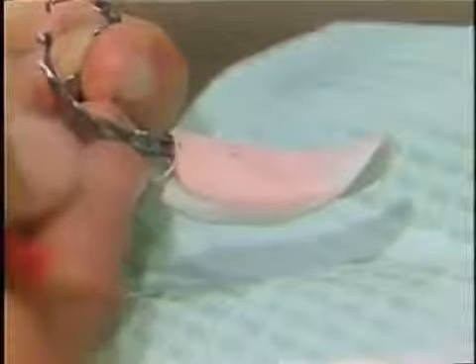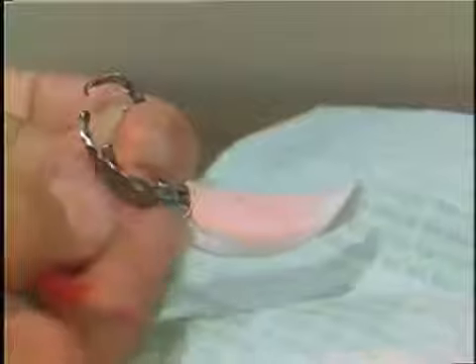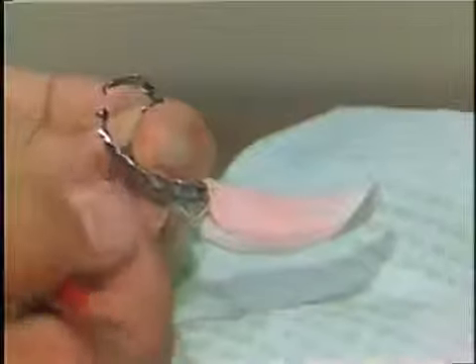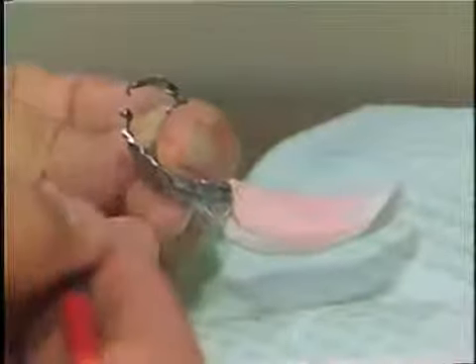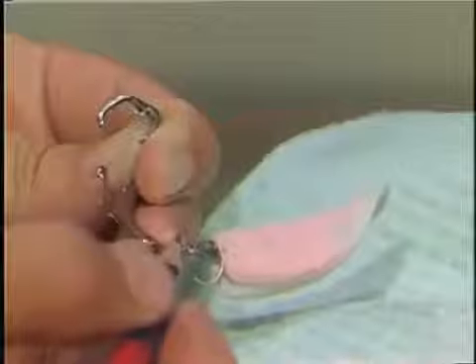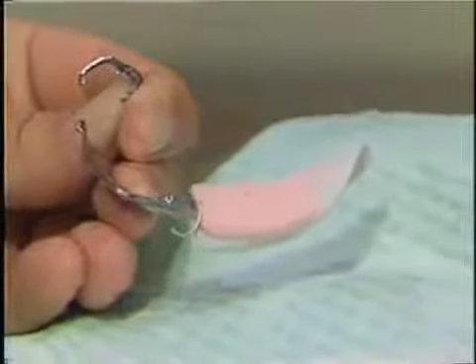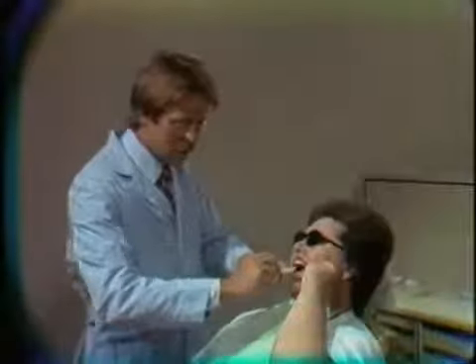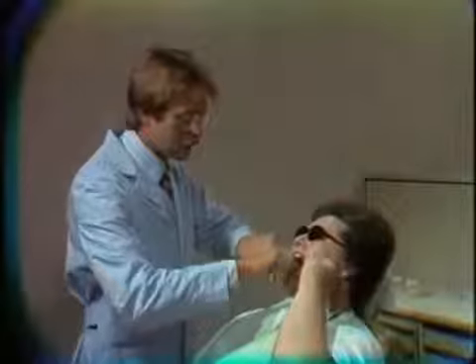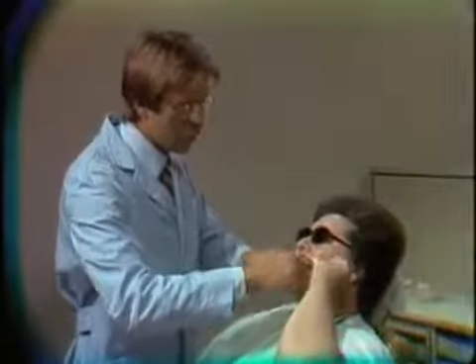We want the patient's teeth to be guided by her musculature, unimpeded by any of the appliance that we're placing in the patient's mouth. And we see that we have some remnants of these little eccentric dots that we had placed previously. Now we have to take this back to the patient's mouth to double check that it does not interfere with the patient's occlusion in any way.